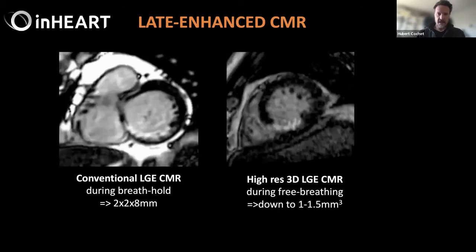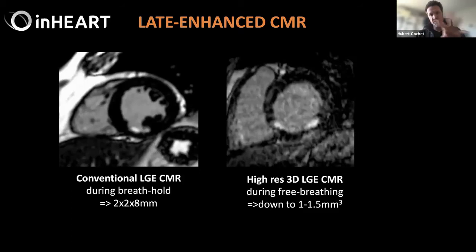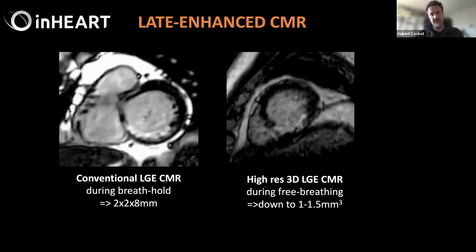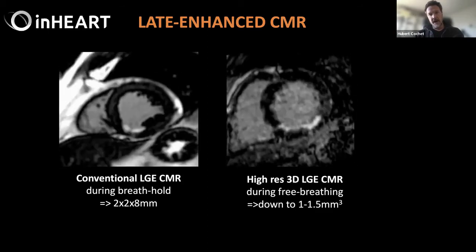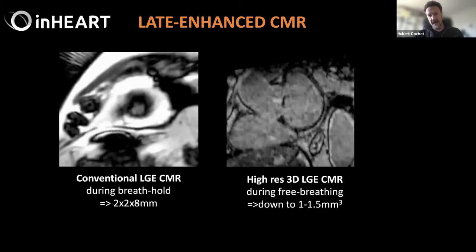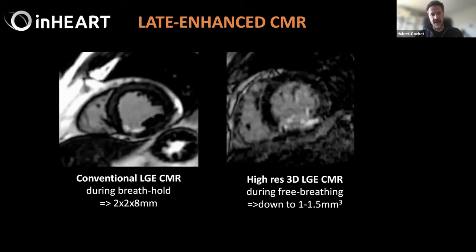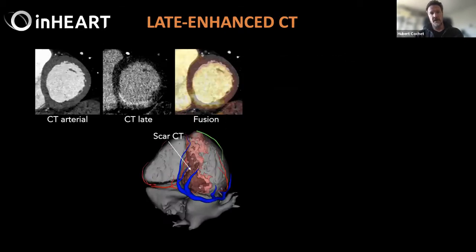So again, the inHEART team has protocols for most vendors of CMR systems and can assist your imaging teams in developing these. The problem with MR is that very often there are ICD artifacts, and these images are heavily hampered by these artifacts. For that reason, we are often implementing in centers late iodine-enhanced CT. So it's the same thing as late GAD-MR, but with CT. You see here an arterial phase CT, here a late iodine-enhanced CT showing an inferior infarct.